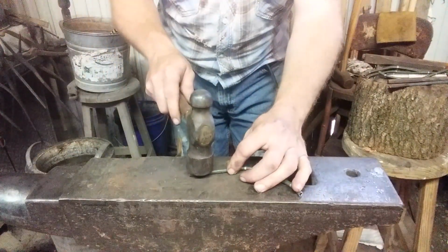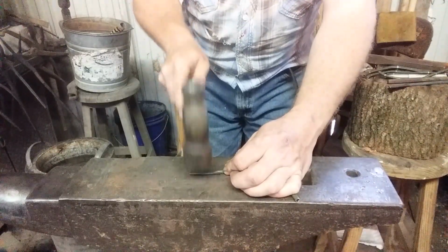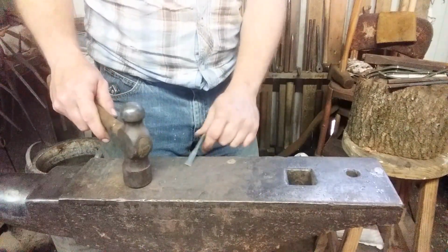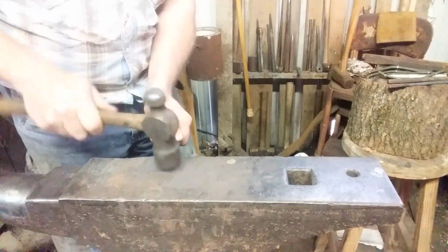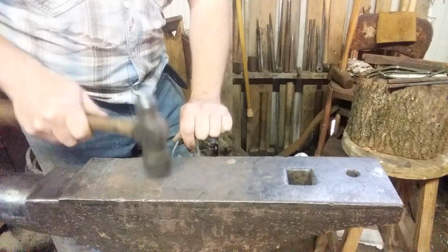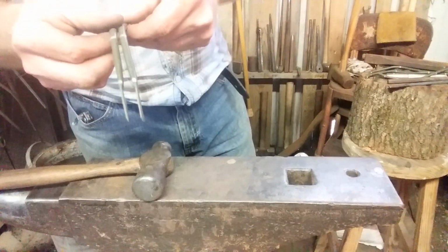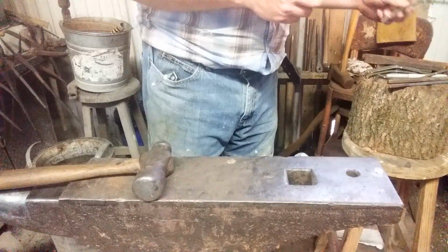So I'm going to do these other ones. I'm turning them opposite. Make sure that it's opposite. Yes, it's opposite. The offset needs to go to one side or the other. So, alright, let's not get mixed up here.